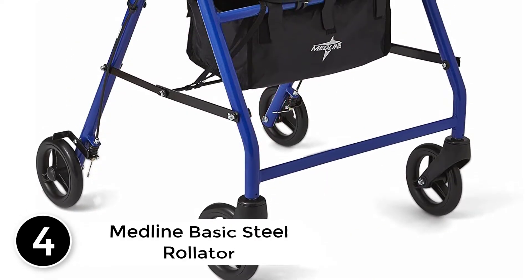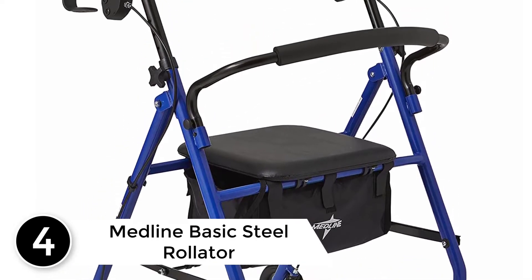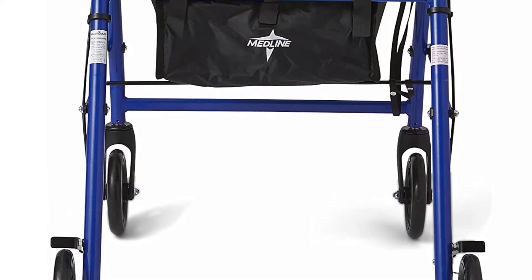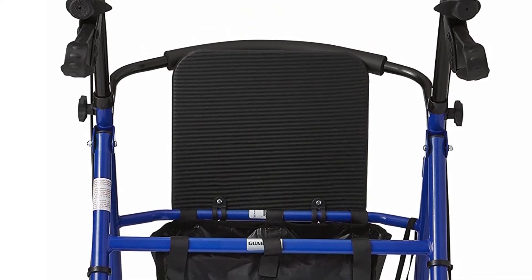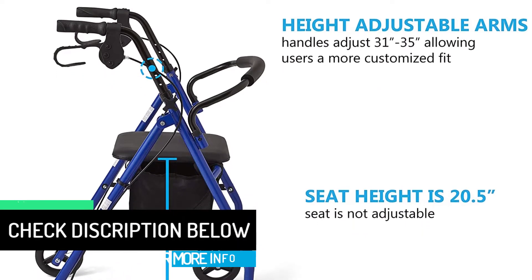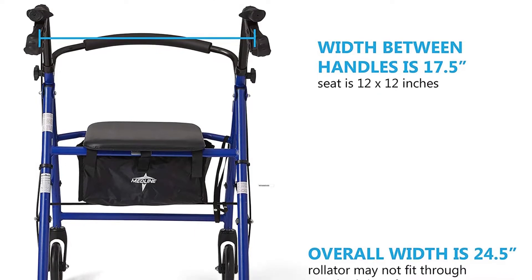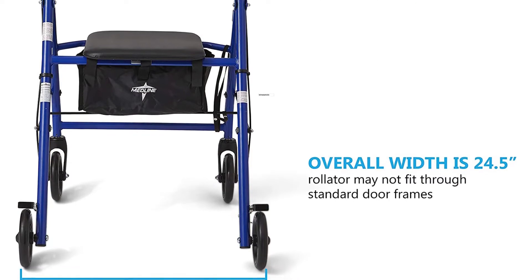At number 4: the Medline Basic Steel Rollator. The powder-coated steel frame makes it a lightweight and durable choice. The rollator folds compactly for storage and includes a padded seat, under-seat storage, and supports weights up to 350 pounds. As the cheapest rollator on our list, we like the affordability factor. In addition to the low price, this rollator has one of the highest weight capacities on our list at 350 pounds, about as high as we've seen on a non-bariatric model.